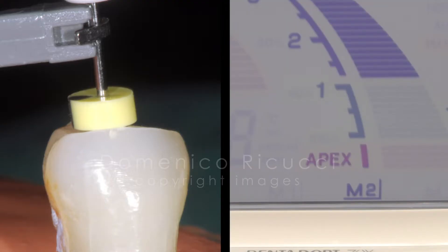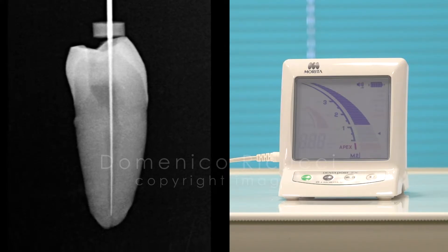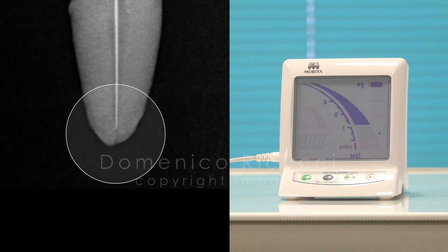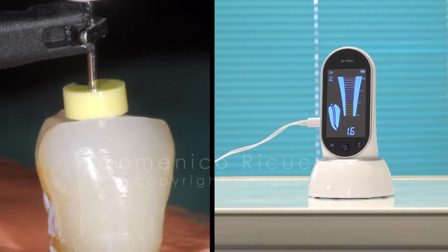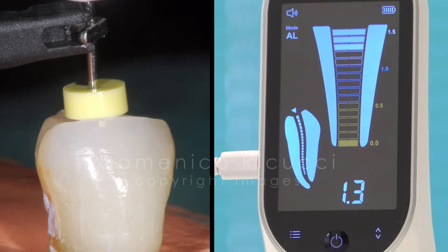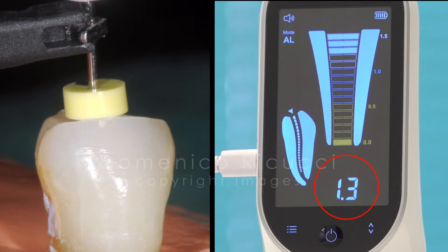The tooth was removed from the experimental model and a radiograph taken. The radiograph showed that the instrument tip was at about 1.5 mm short of the radiographic apex. This measure was recorded and the K file was introduced in the same canal at the same depth, this time using the Apex device. The electronic measurement done with Apex indicated the value 1.3.